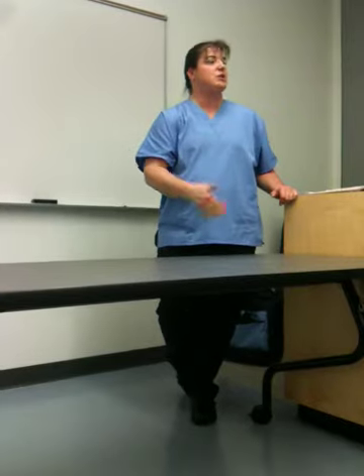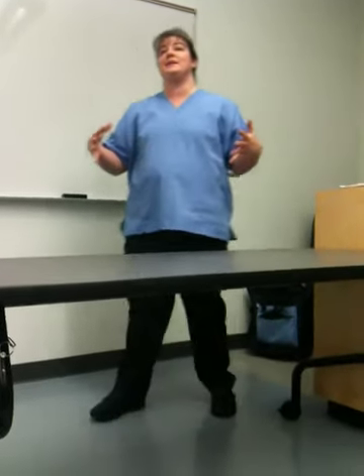Now there's a lot of question about what comes up when you get a no shock advised. You go straight to CPR with chest compressions. You don't go back and check breathing and pulse. That happens a lot, and it probably shouldn't, and I'm not going to absolutely fault anybody for doing it, but if we're sticking straight to the guidelines, we don't recheck breathing and circulation, whether you get a shock advised or a no shock advised, because typically right after shocking or no shocking, there isn't one, and you need to get onto compressions in order to create that. So what we're looking for is a patient who begins to purposely move or wake up while you're doing this, and then we can stop and reassess the quality of circulation and breathing.